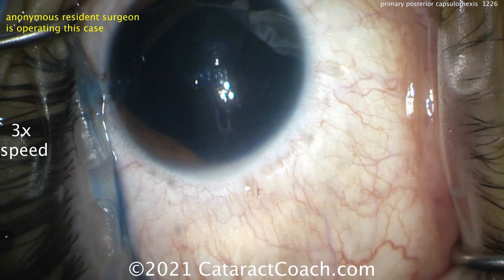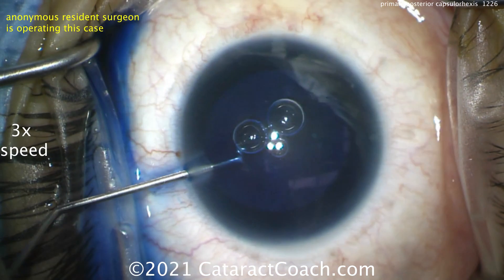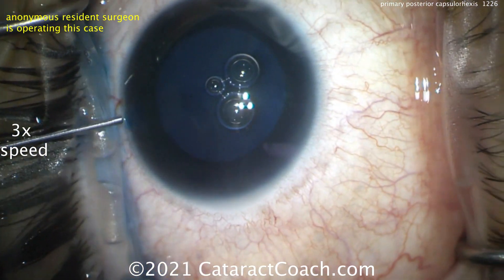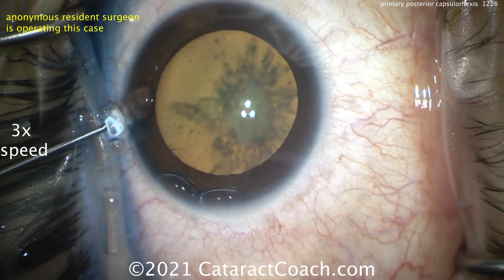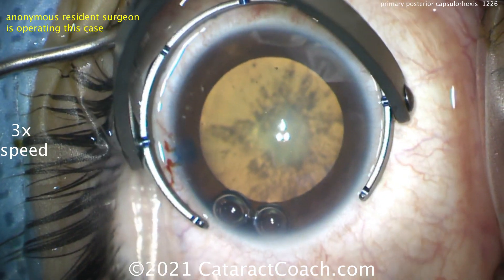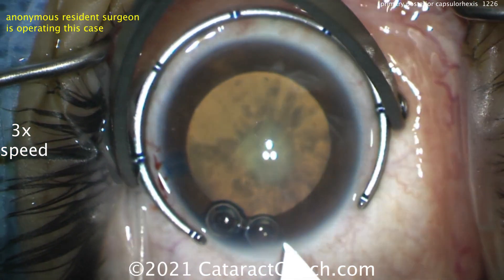Why do you put TriPen Blue dye in if you have good red reflex? Well, remember, the other advantage of TriPen is it makes the capsule a little bit less elastic. In a 29-year-old like this, that capsule can be very elastic. This patient is a type 1 diabetic, and this cataract has been developing over the last couple of years.